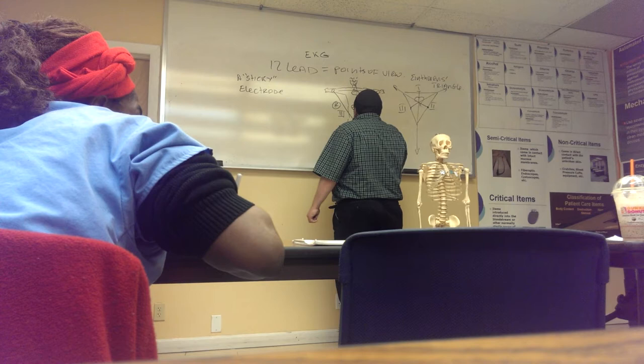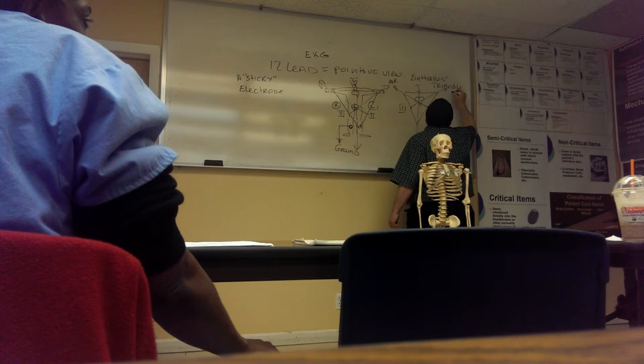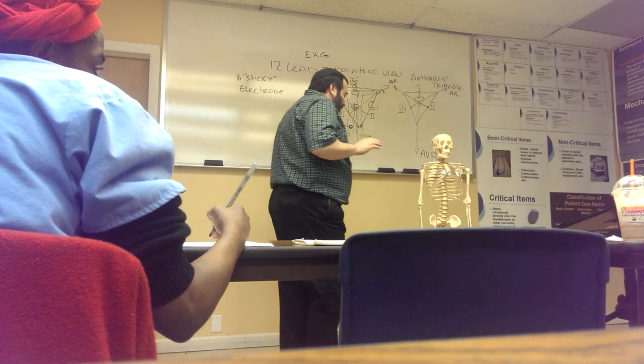I call this guy over here, looking from there to there, AVR. This guy, looking from this side to the left, AVL. And this one I'm going to call AVF. Now, I'm not going to get into the science behind it, but I will tell you everything that I can.